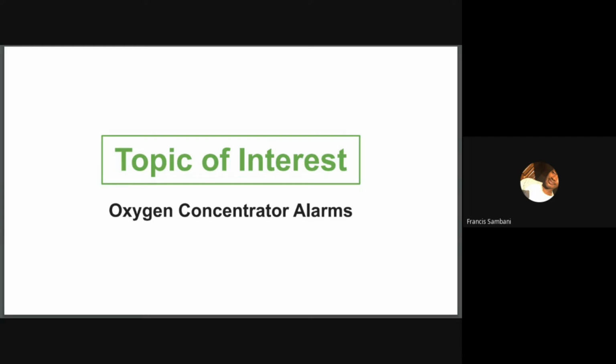So when it is below 83.5% and down to 75%, the yellow or low oxygen light will turn on without an audible alarm. And when the purity is less than 75%, that is from 60 to 75%, the yellow low oxygen light will light up, and it is also accompanied by a beeping audible alarm. And when the purity is less than 60%, the service required or red light will go on, as well as the beeping audible alarm.